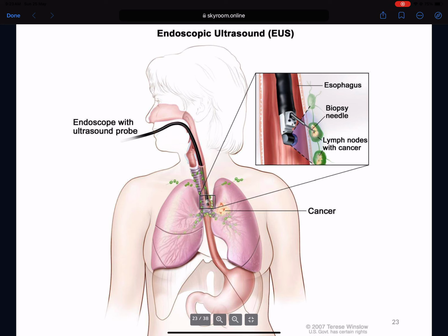and you can also make a biopsy, because the endoscopic ultrasound, all of them, have a small needle for making a biopsy, and you can evaluate if these lymph nodes are tumoral or not.